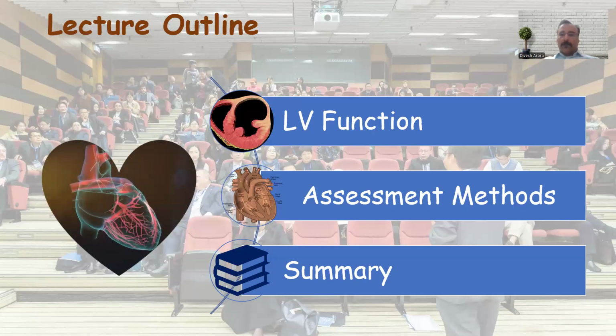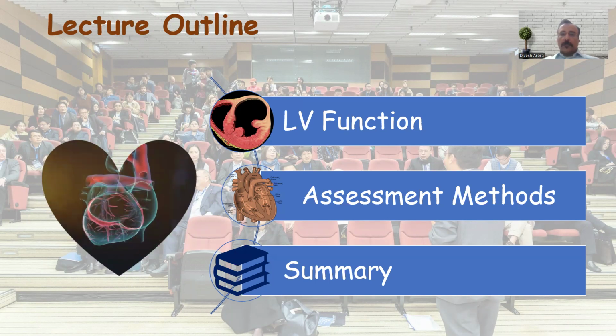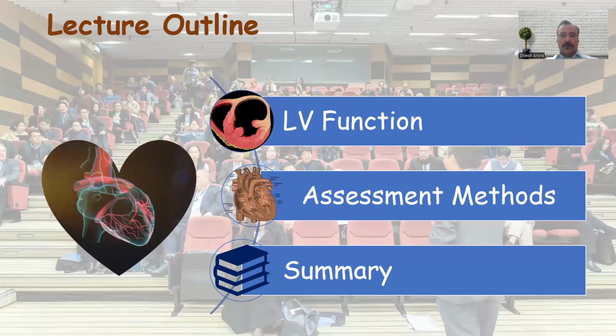So this is how I have planned my lecture. We'll try to understand what actually is LV function, why is it important to the anesthesiologist, what are the various assessment methods which are available in the armamentarium as a POCUS modality, and in the end, we'll like to summarize our findings.